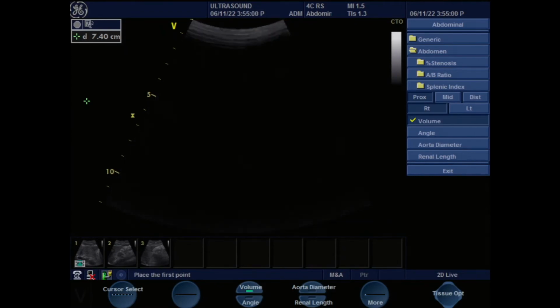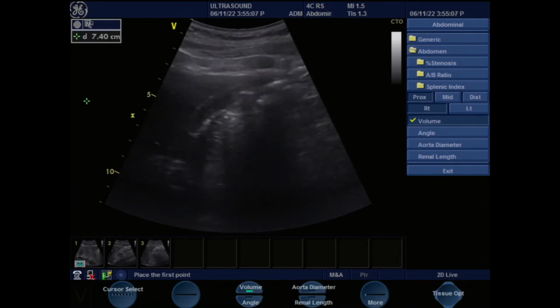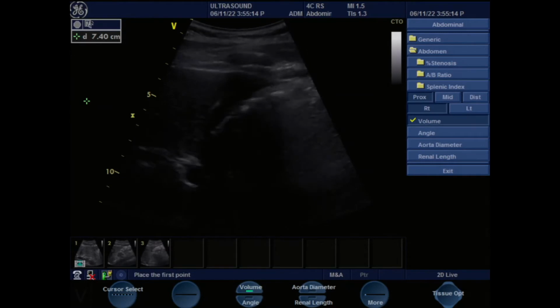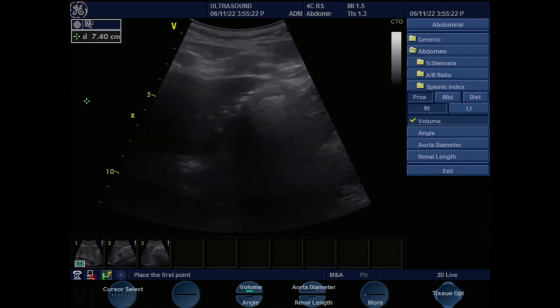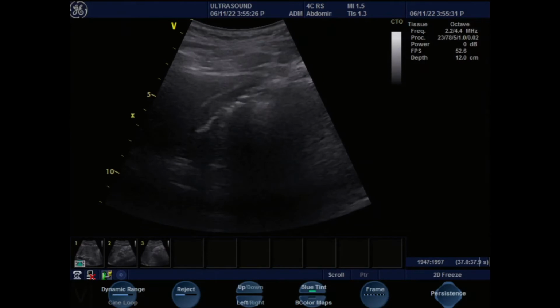So moving on to the gallbladder. Hussain Bhai was given specific instructions to have a double meal and make sure he ate really well for the test. Yes, so someone miscommunicated. Typically, we need the patient to be fasting a minimum of 4 hours. So this is a classic example of what we would get through the emergency setting.